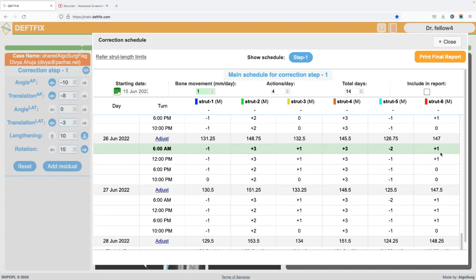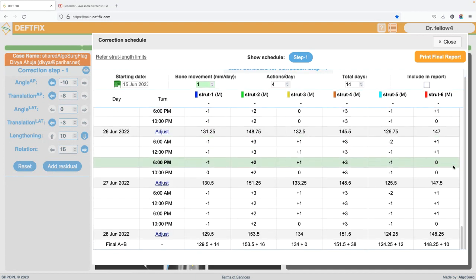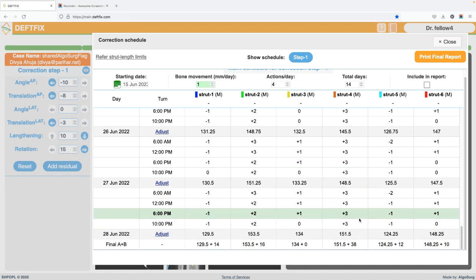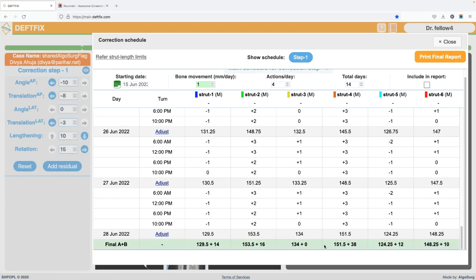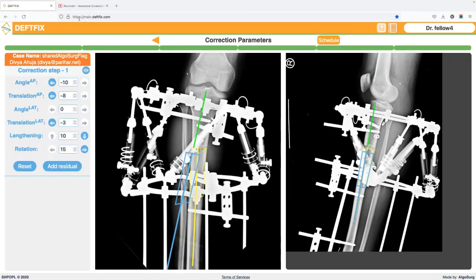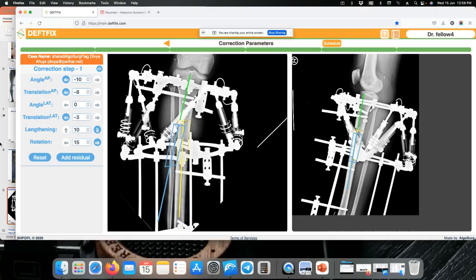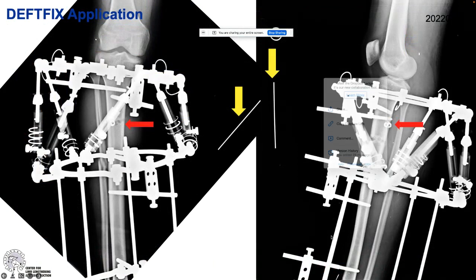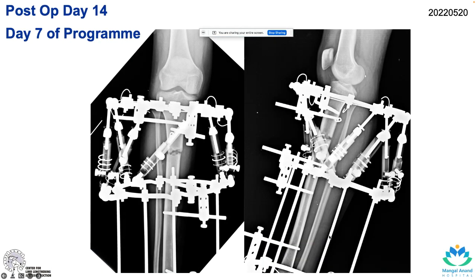We have a program for 14 days with no red flags — all struts are well within the limit and do not need any adjustment. At seven days of distraction, some distraction has happened at the osteotomy and a little translation has also occurred. Earlier the center bolts were well aligned; now the middle ring center bolts are slightly turned, indicating some rotational correction has also happened.